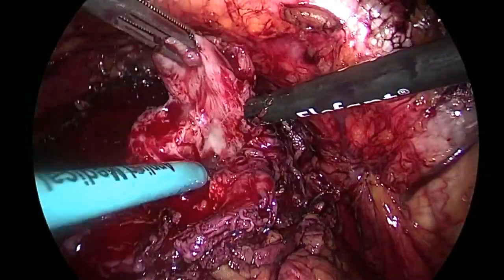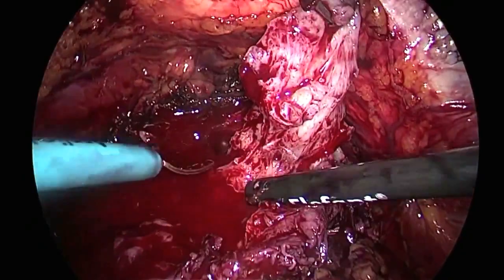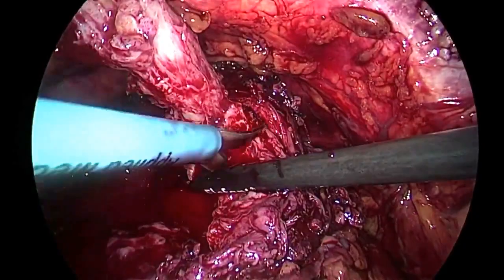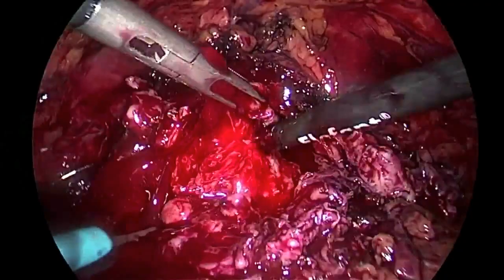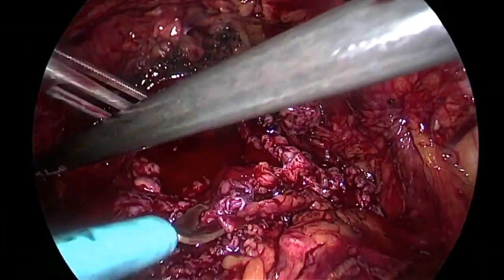Clean. Down. Another small adenoma here. Very small. Stop. Here.